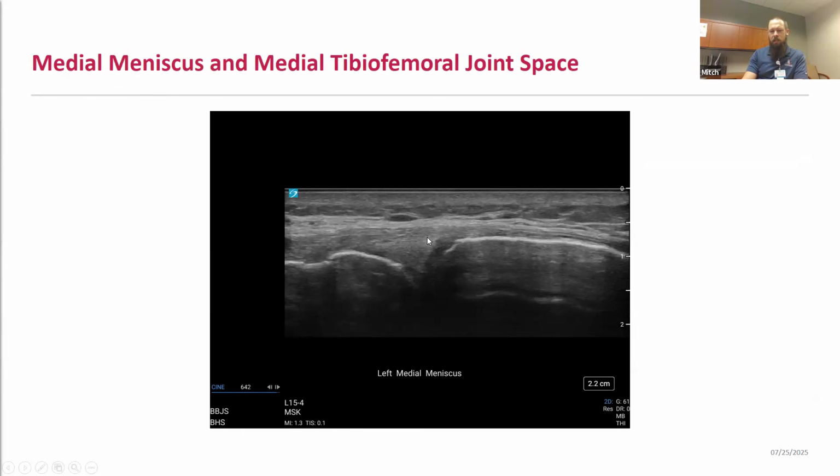With ultrasound, it can be a good tool to rule in meniscal pathology, but because you get incomplete evaluation of the meniscus, if you're not seeing any abnormality on the meniscus, it doesn't necessarily rule out any pathology. But ultrasound can be reliable in detecting peripheral tears of the meniscus. You can see a hypoechogenic cleft through the meniscus. Sometimes you can see areas of hypoechogenicity within the meniscus, which may indicate degeneration versus tearing. You can identify parameniscal cysts with ultrasound. And so these are all different things that you're looking at, scanning at the medial aspect of the knee.